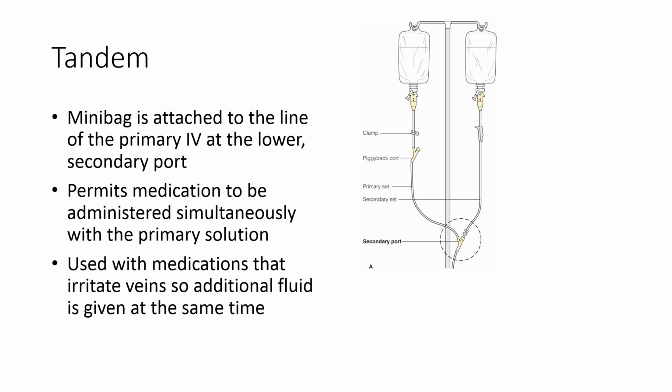We use this with medications that may be irritant to veins, so additional fluid is given at the same time, or if they need both medications because the patient may be dehydrated or require that fluid and only have one IV, and we really don't want to stop that main IV, that would be a reason for using the tandem method.